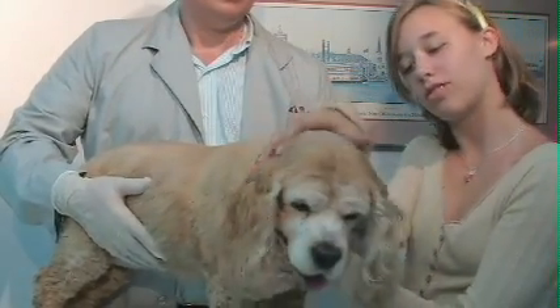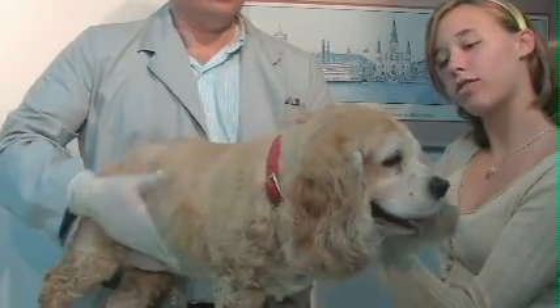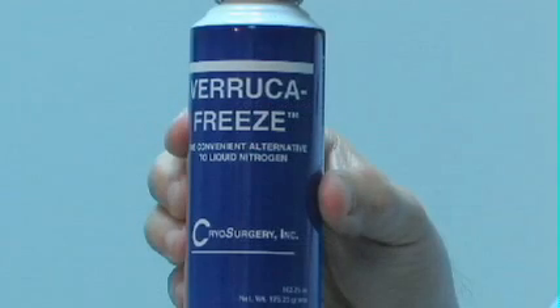Traditional treatments such as removal by scalpel are time consuming and put many animals at risk by placing the patient under anesthesia. Treatment with liquid nitrogen can be very expensive because it requires expensive accessories or delivery devices and evaporates at 3-5% per day, requiring monthly replacement regardless of usage. Cryosurgery with Veruca Freeze is one of the most cost-effective surgical procedures available to veterinarians today.